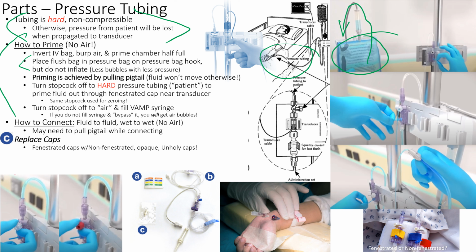So place the flush bag in there, priming it by pulling a little pigtail right here, and there's what are called fenestrated caps, right? So there's fenestrated caps and non-fenestrated caps. What does fenestration mean? What does fenestrated mean?